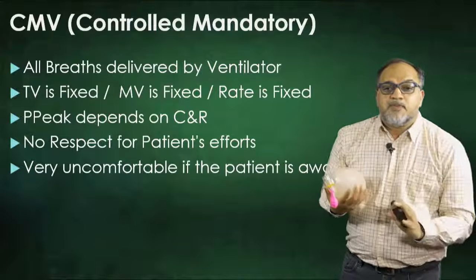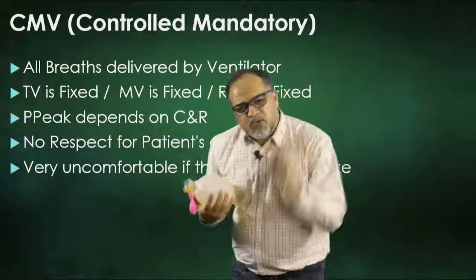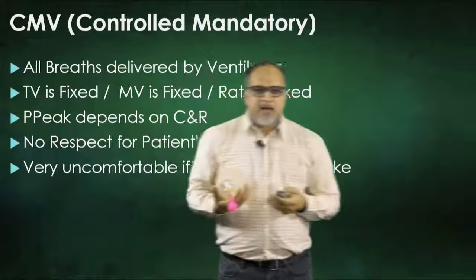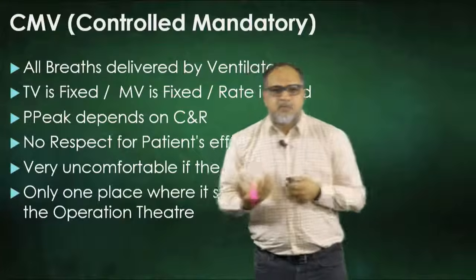And it is very uncomfortable if the patient is awake. And believe me, most of the time, in most of the ICUs, we see patients on CMV all the time, fighting the ventilator. But that's the harsh reality. If we could change one thing with this lecture, I'd be more than happy.